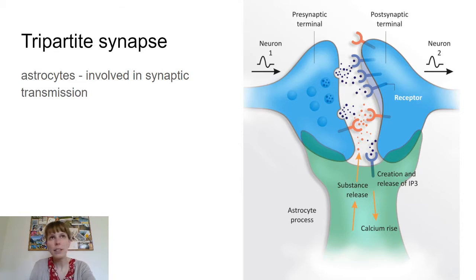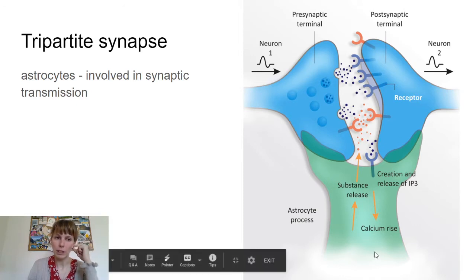So astrocytes, like you are going to see everywhere, support and provide nutrition for the neurons. They are also not only passive. They also play a role in the synapses. This kind of synapse would be happening between the axon terminal and, for example, the dendritic spine, but the astrocyte will also usually be involved.